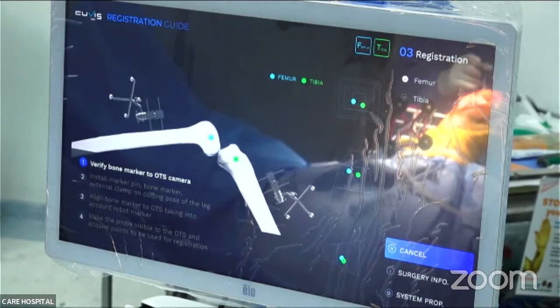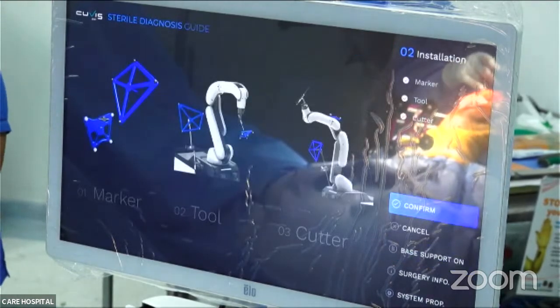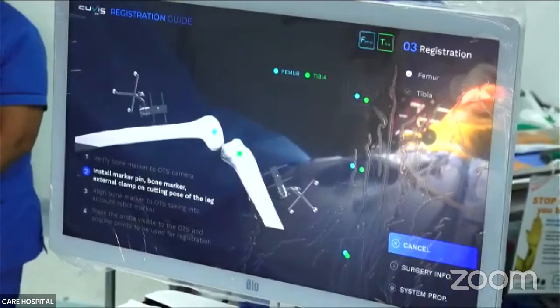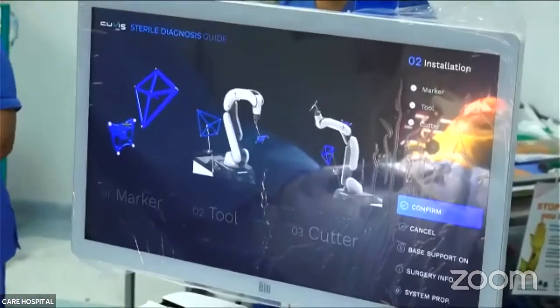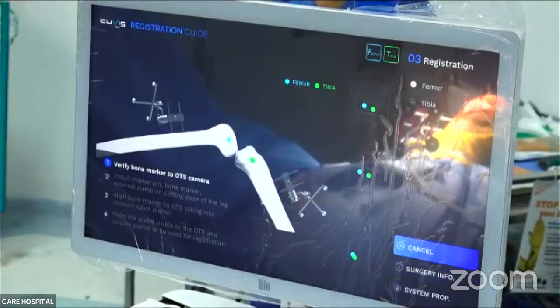Now, if you put a point on the medial aspect when it is asking for proximal medial, then the whole plan will go wrong. Yes, we have to be very meticulous in that CT planning because it follows the principle of garbage in, garbage out. If you make a mistake in the planning, it will affect the whole surgery.